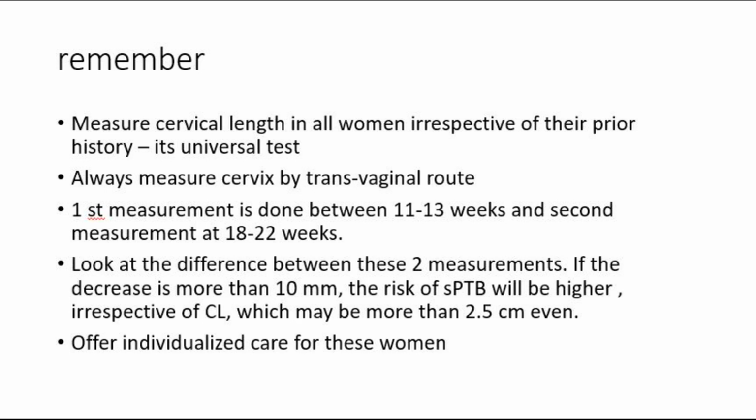Remember, always measure cervical length in all women irrespective of their prior history. It is a universal test. Always measure cervix by transvaginal route. First measurement is done ideally between 11 to 13 weeks and second measurement at 18 to 22 weeks.